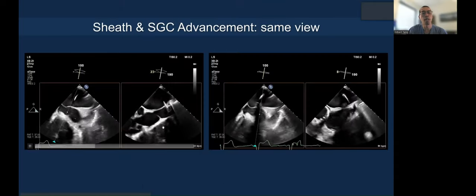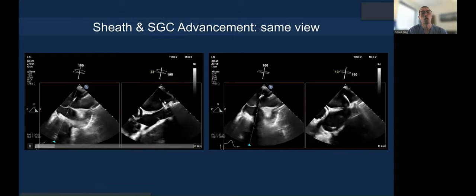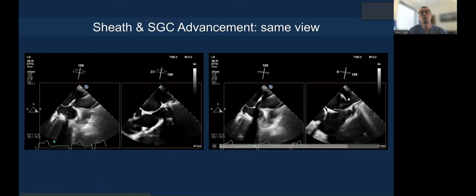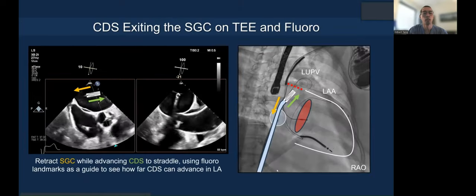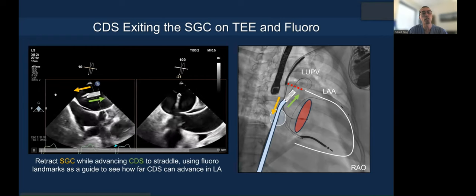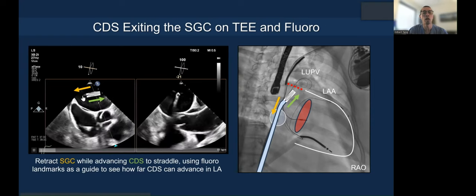Here's how it looks — you can see the guide now with the dilator coming across through the septum, with the serrated contour visible on echo. The guide is well into the left atrium. While you advance the clip out of the guide, you can retract the guide and stabilizer at the same time to facilitate straddling.